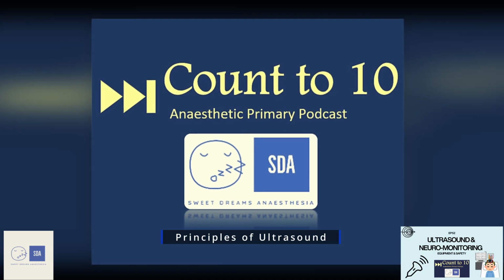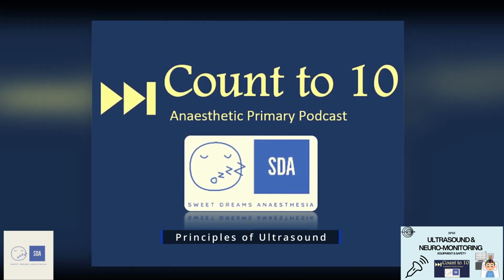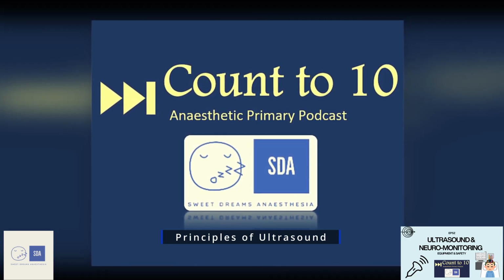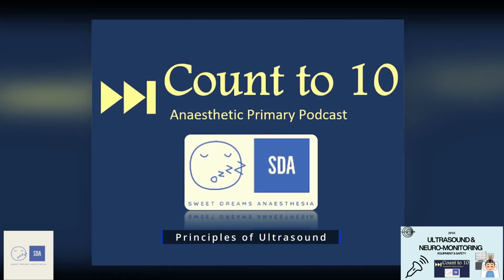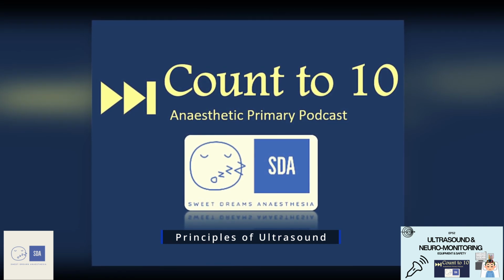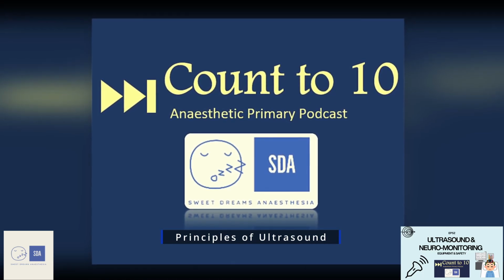Now let's take this understanding of image generation to the next level by introducing a concept of acoustic impedance. Acoustic impedance refers to the property of any physical tissue that dictates how sound wave travels through it. And the main property that dictates how sound wave travels through a tissue is generally the density of that tissue. So each tissue in our body can be labeled with its own acoustic impedance.